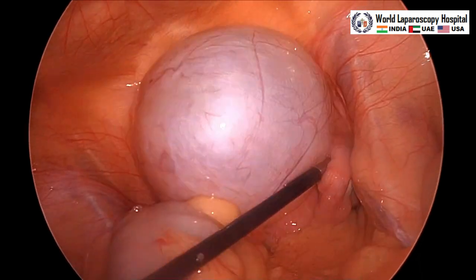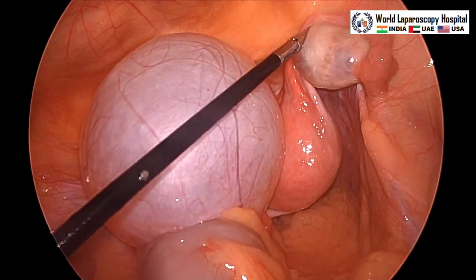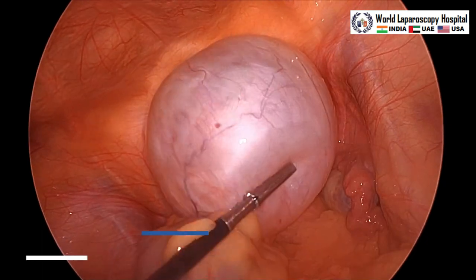This is a simple cyst, but it is a little large — approximately 7 centimeters. The first step is that we will do aspiration.